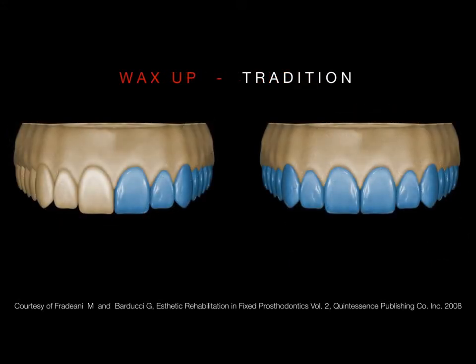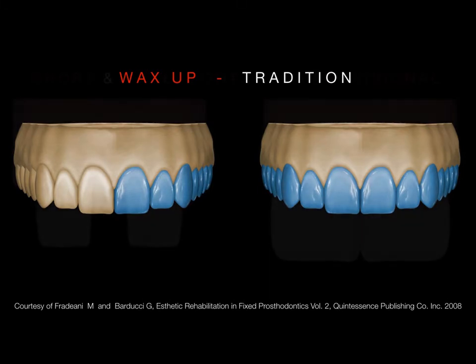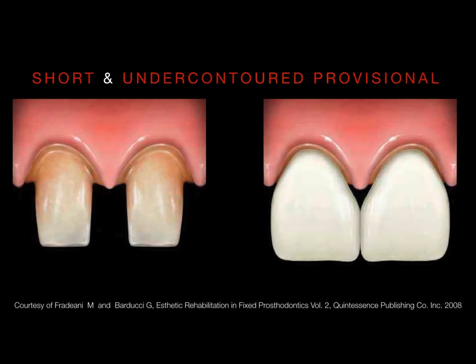So normally what you see in normal cases, the technician will do the wax-up until the margin between the gingiva and the tooth. That is a quite traditional way to do the wax-up. But once you fabricate the provisional, the shell that you obtain will most of the time be shorter and under-contoured because of the contraction of the acrylic resin, which is visible in many cases.